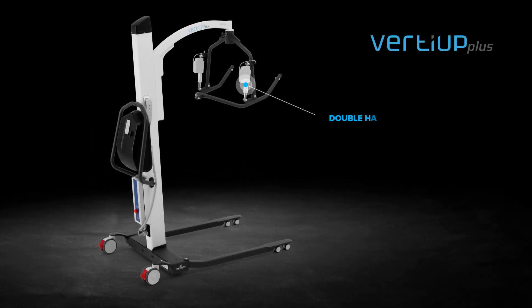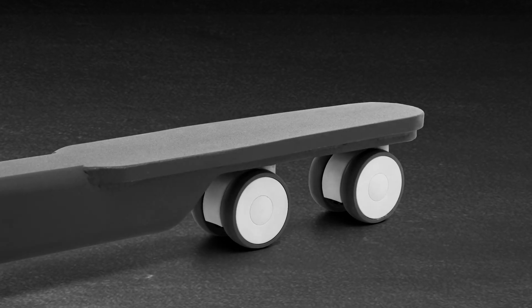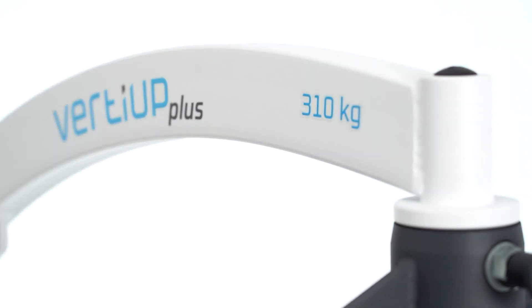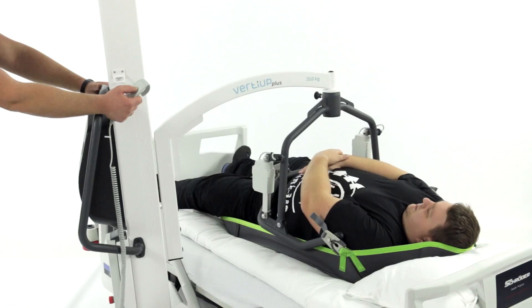The spectacular load capacity of 310 kg and one of the largest available lifting ranges make the Verdi Uplift the perfect universal solution in many hospitals, rehabilitation centers, and nursing homes.